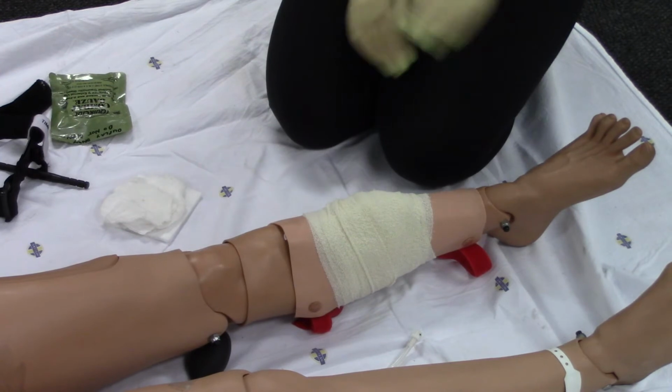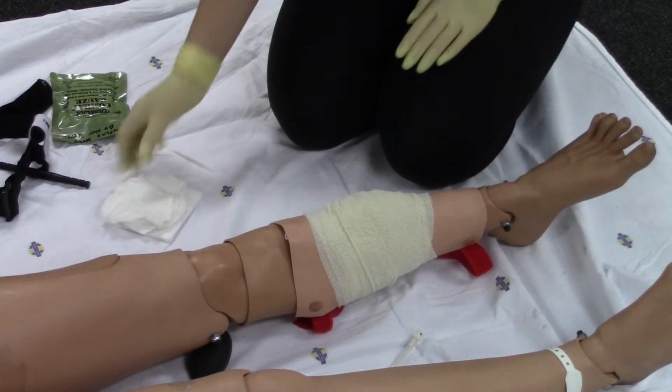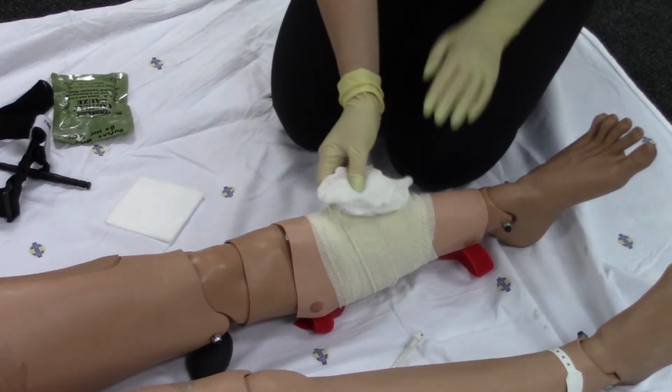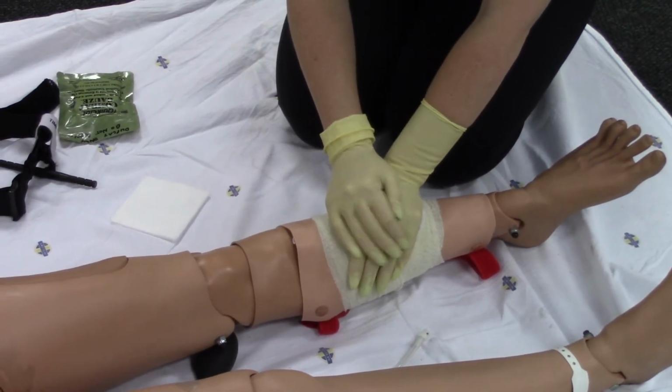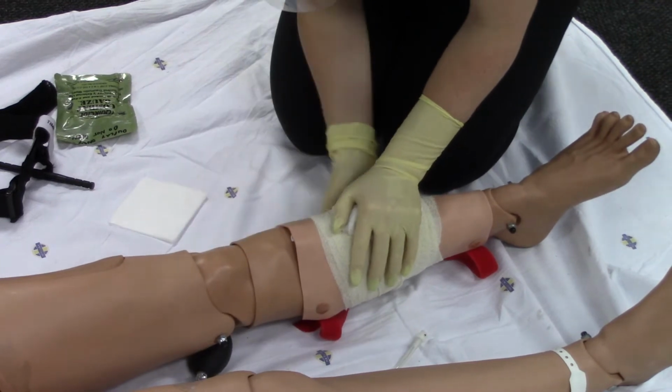If the bleeding does not stop, apply more pressure without removing the soaked dressings. Elevate the limb above the level of the heart if no fracture is suspected.